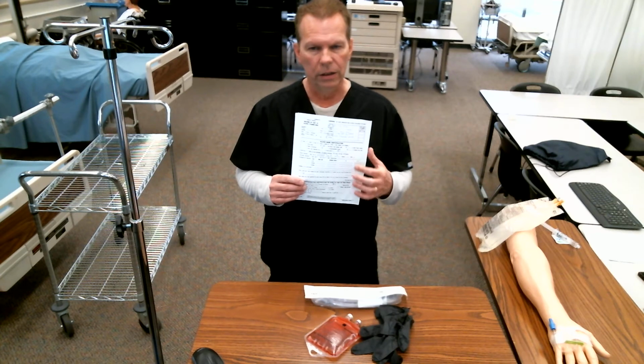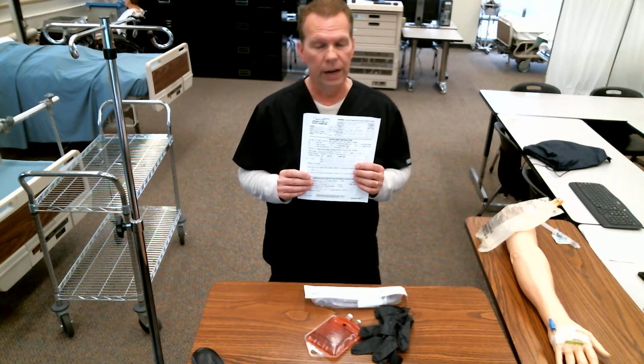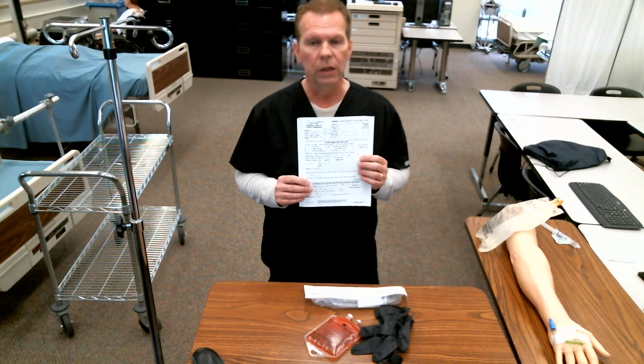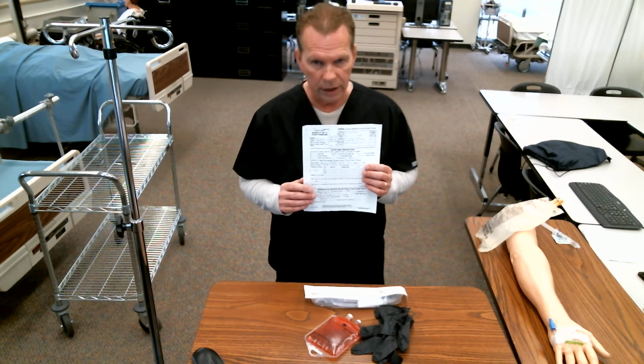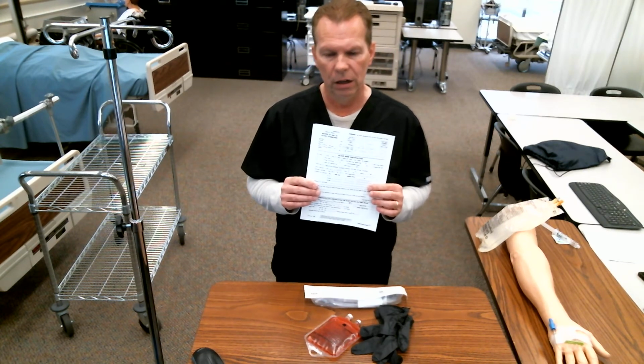Okay, everybody look number by number because it's easy for the brain to get fooled, for the eyes to get fooled, and you end up with the wrong blood. So we want to be very careful. So make sure that you check all of those.